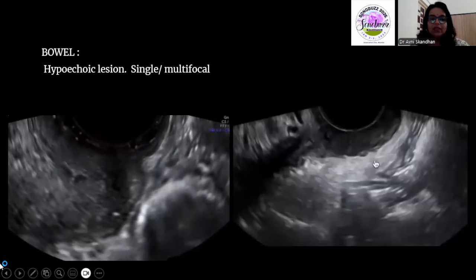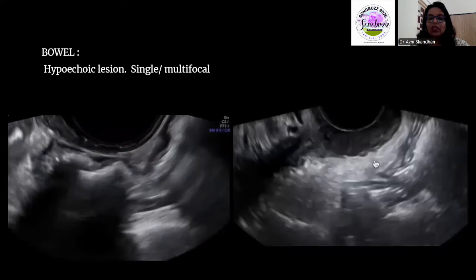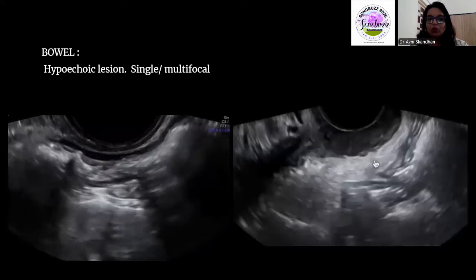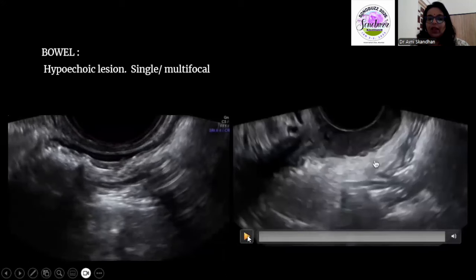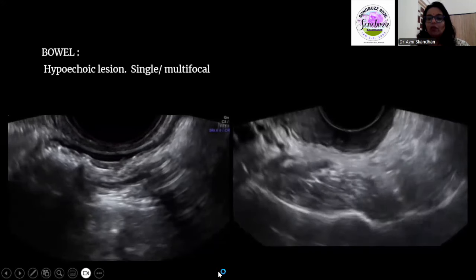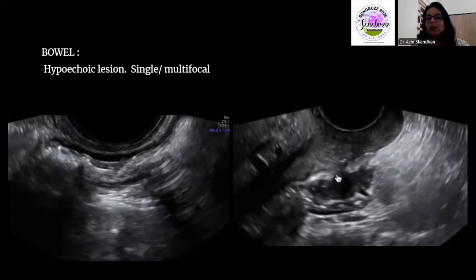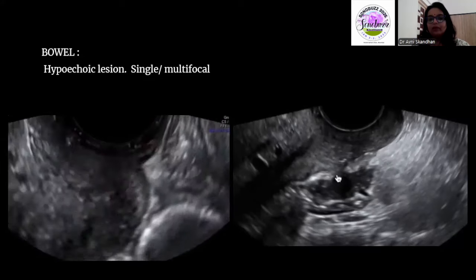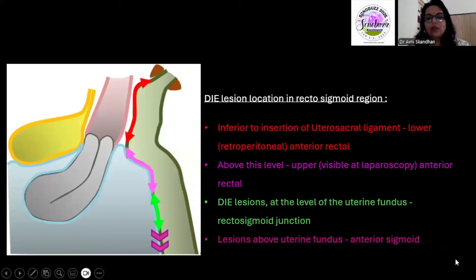Here we can see a normal ultrasound image where you can appreciate the normal bowel wall layers beautifully. This is for comparison. In a case of involvement, you can see the bowel wall with a deposit in the rectum extending to the rectovaginal septum and up to the vagina. When you see bowel involvement, the description of location follows specific terminologies suggested by the IDEA guidelines.